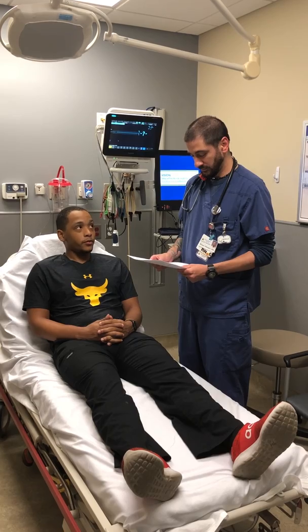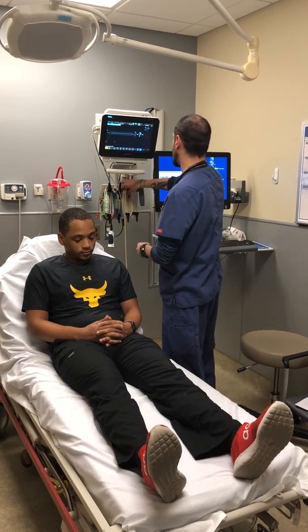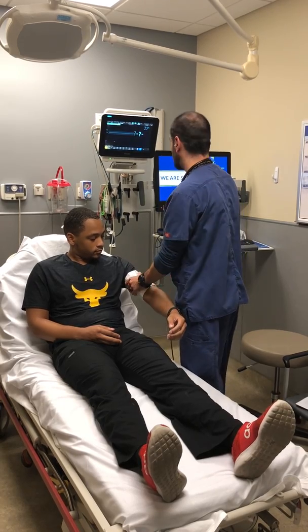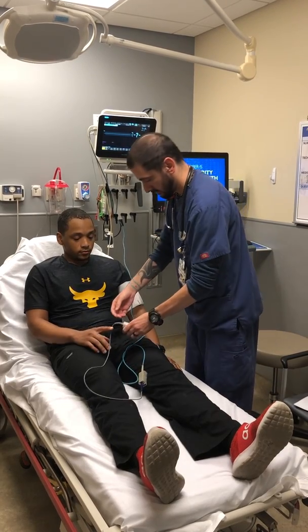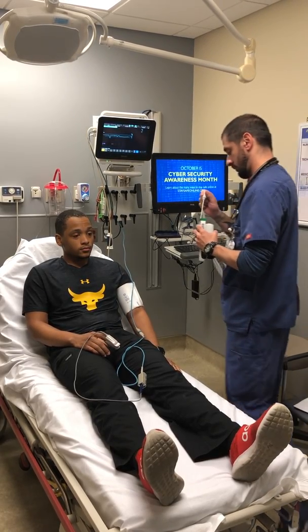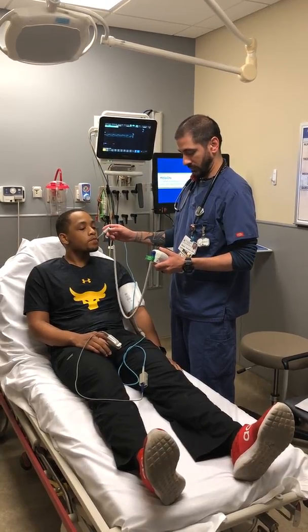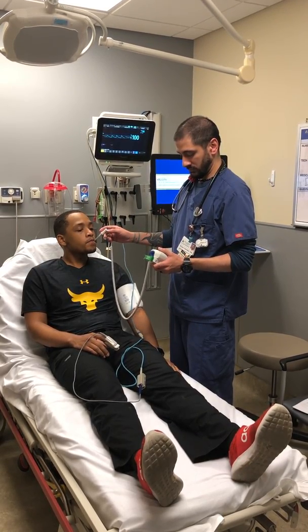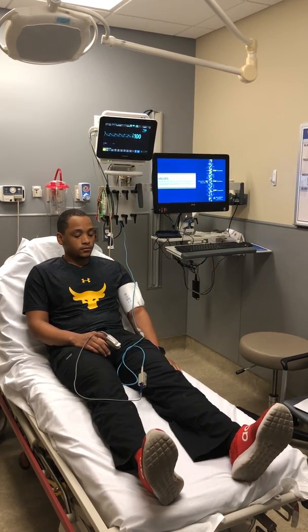And how old are you? 23. Alright, so we're going to start out by taking his vital signs. We're going to get his blood pressure, his oxygen saturation, and his temperature. Temperature of 98 degrees Fahrenheit is within normal limits.